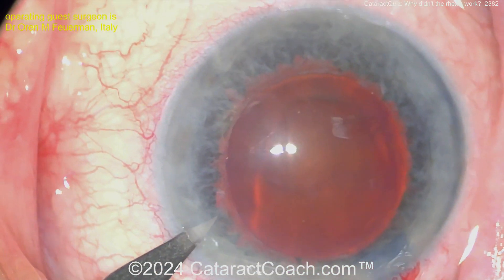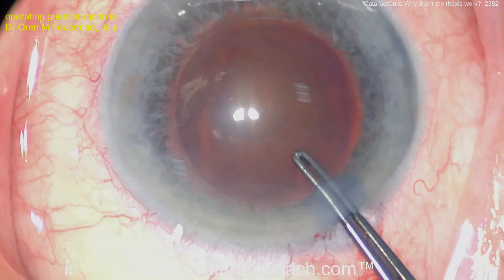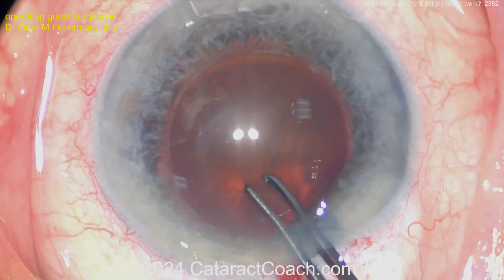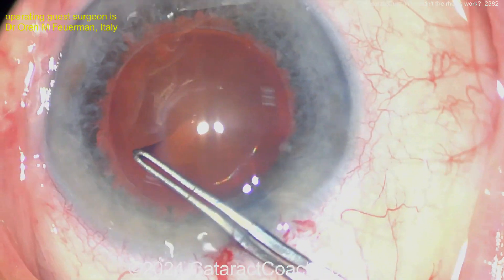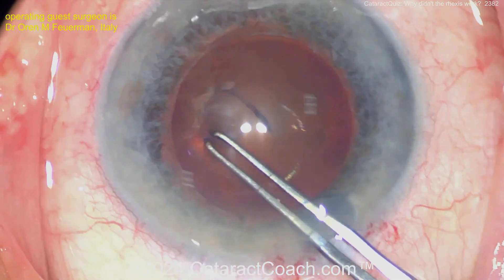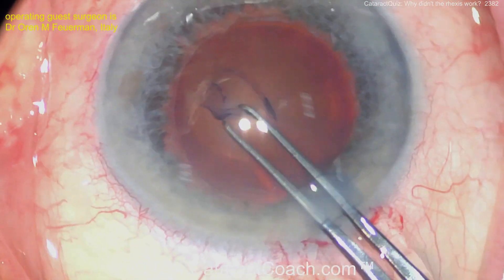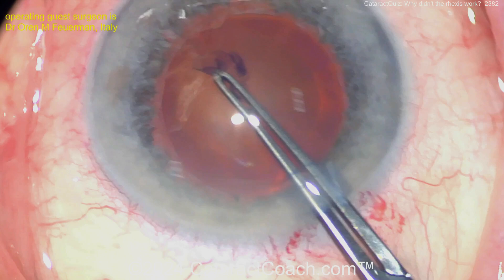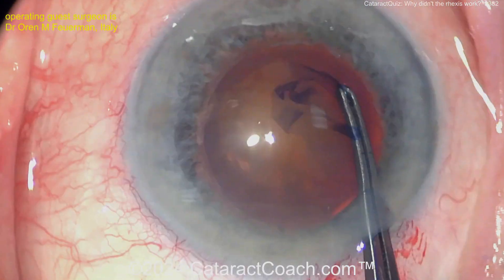Maybe a little soft shell technique here. Here's a paracentesis going in with the forceps, kind of poking in — that's a style I like too. Having a little bit of a tough time, but there we go — poked in and now continuing around and around, keeping this nice and curvilinear.